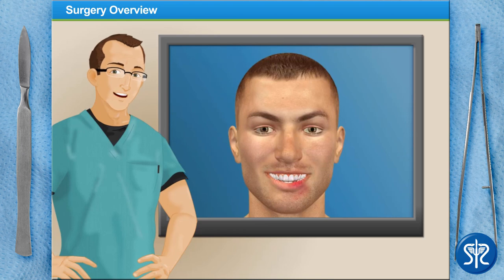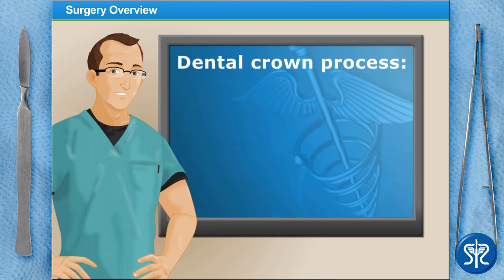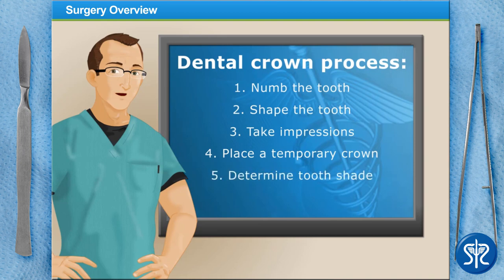Our patient came in today with a broken tooth courtesy of a freak softball accident, and we get the rewarding task of placing a crown. It's one of their lower front teeth — tooth 23. Here's what we'll do today: numb the tooth, shape it, take impressions for our dental lab, place a temporary crown, and determine the shade of the tooth. When our patient returns for their next appointment, we'll place their permanent crown.